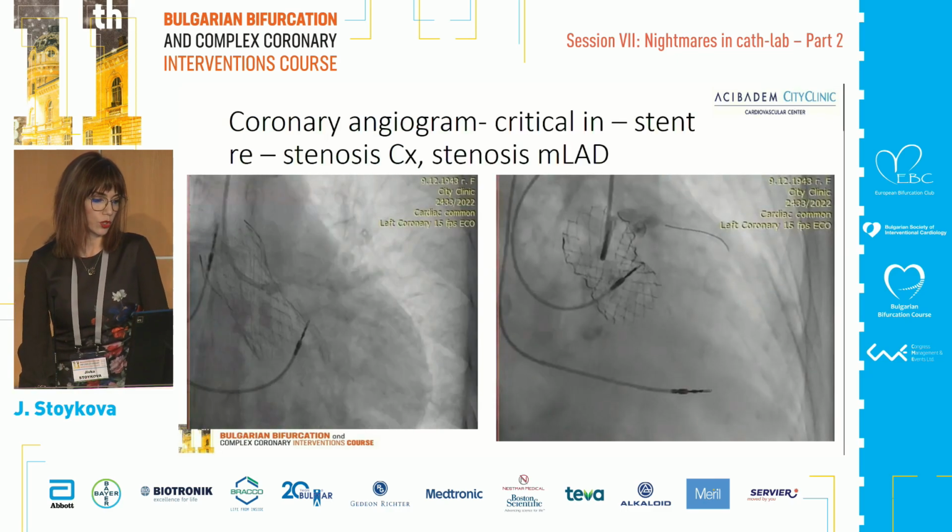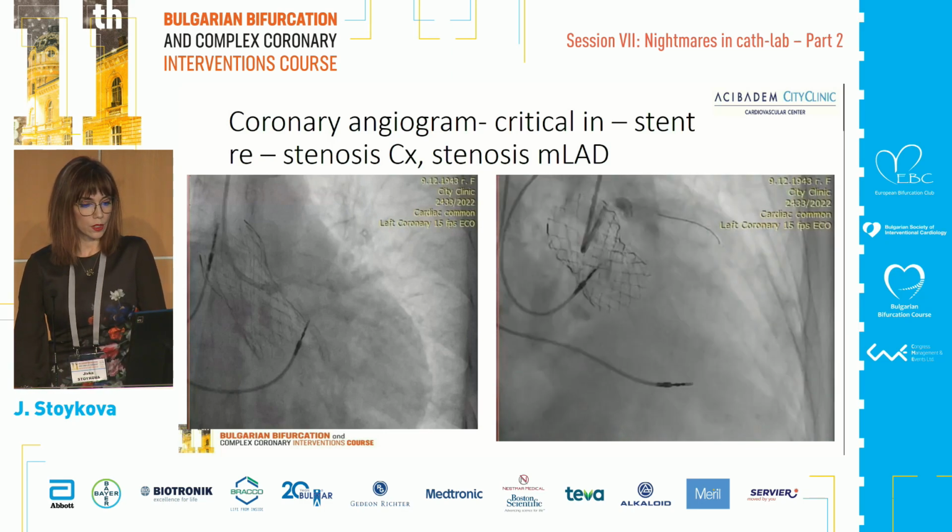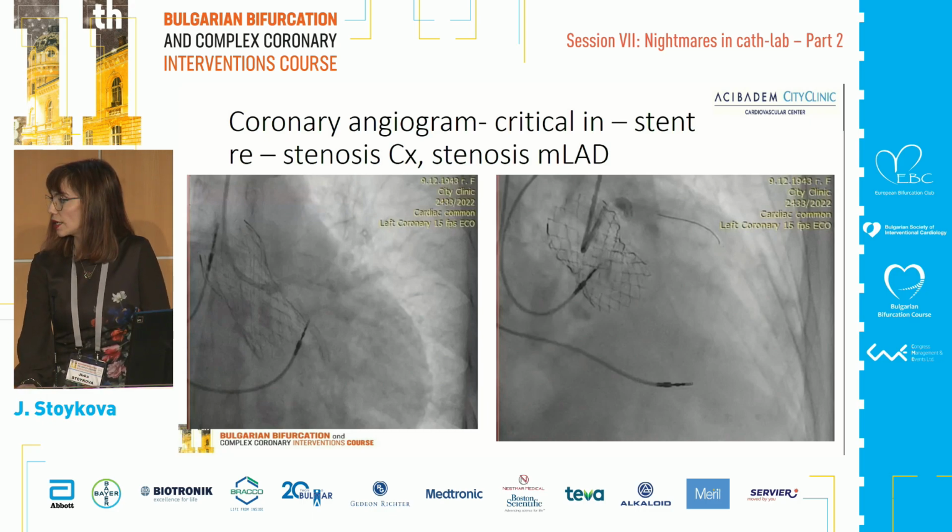And this is the angio. We saw severe in-stent restenosis of the circumflex and severe stenosis in the mid part of the LAD.